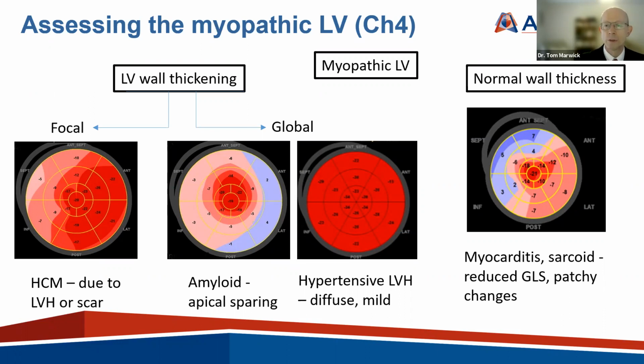Ted, what's your feeling about using this in the hypertrophic ventricle? Do you have experience with that? Yes, we do use it almost in everybody that comes in with a suspected or known diagnosis, and also in their family members when they're being screened for hypertrophic cardiomyopathy. It's a great tool, and we've really been very enamored.